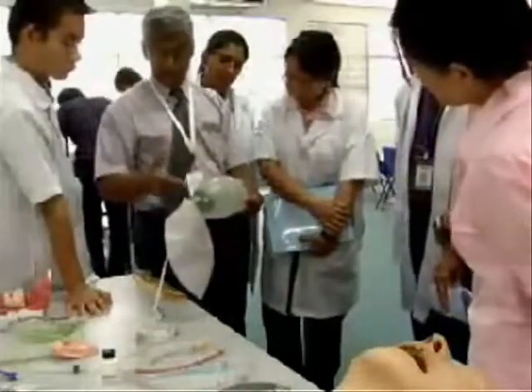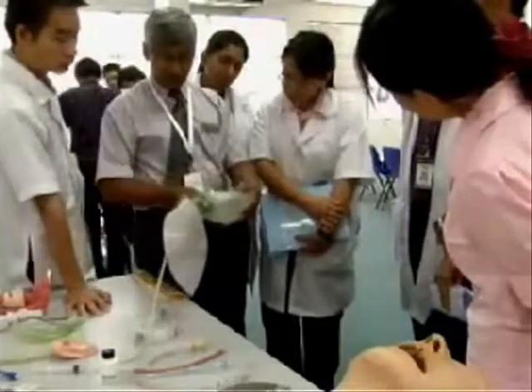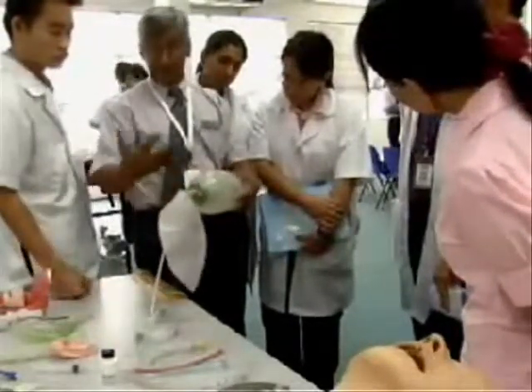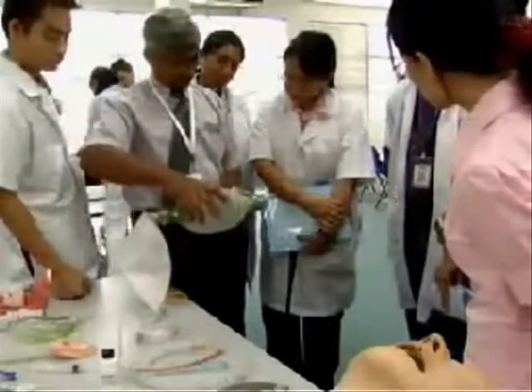One-way valve. So when you press, this valve closes and this valve opens. When you let go, this valve opens and this valve closes.